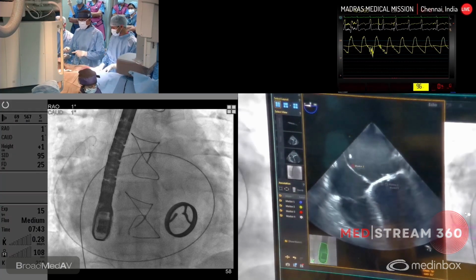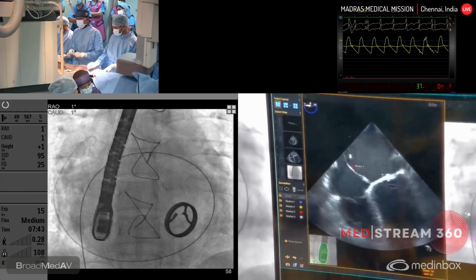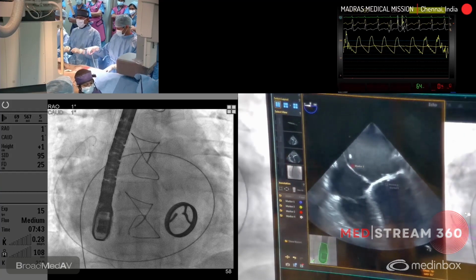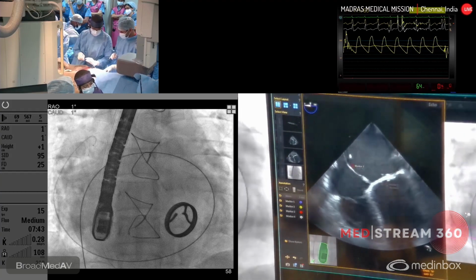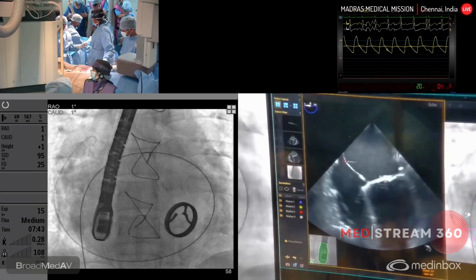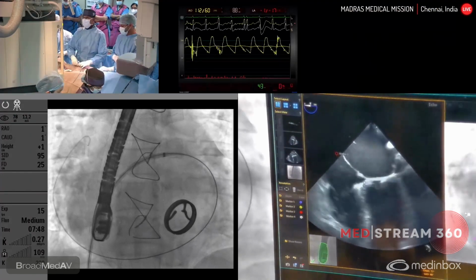This patient had paroxysmal atrial fibrillation on and off. Right now seems to be having some form of a stable rhythm, even though we are not appreciating a clear-cut P wave. I wonder if it is a flutter with a 2:1 block. So can I have a dilator? So this is a Fustar sheath, which is a steerable sheath. We have now put it into the left atrium.